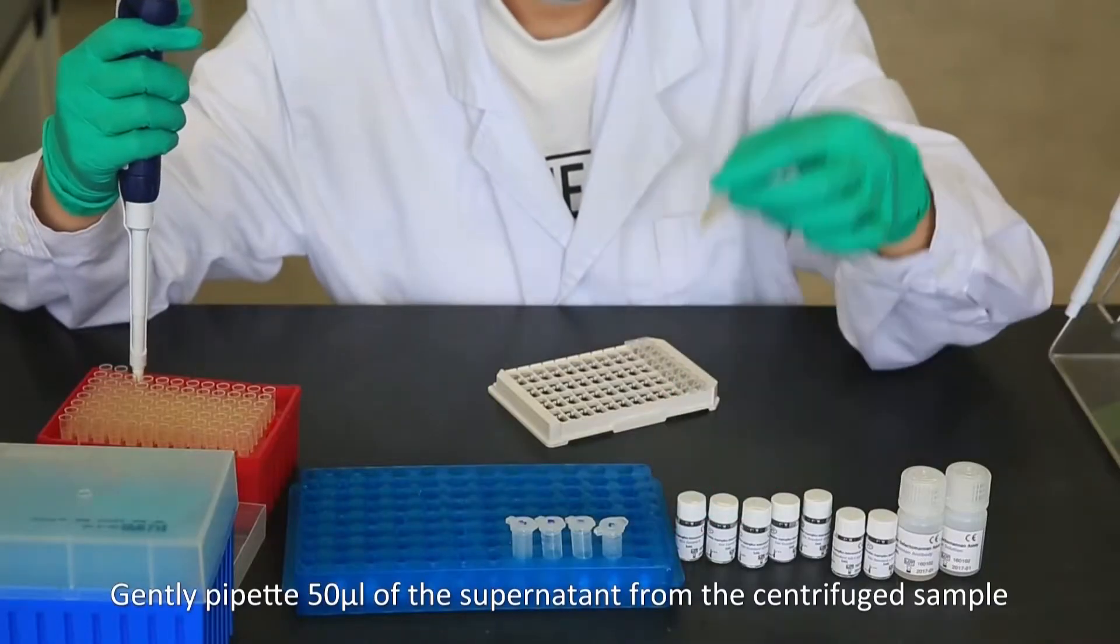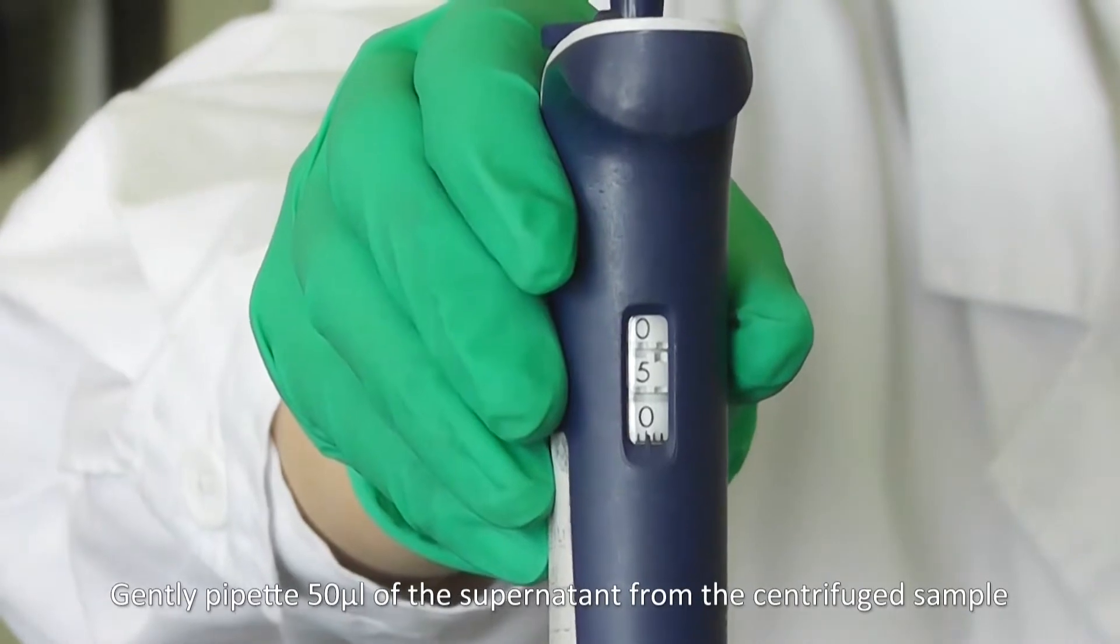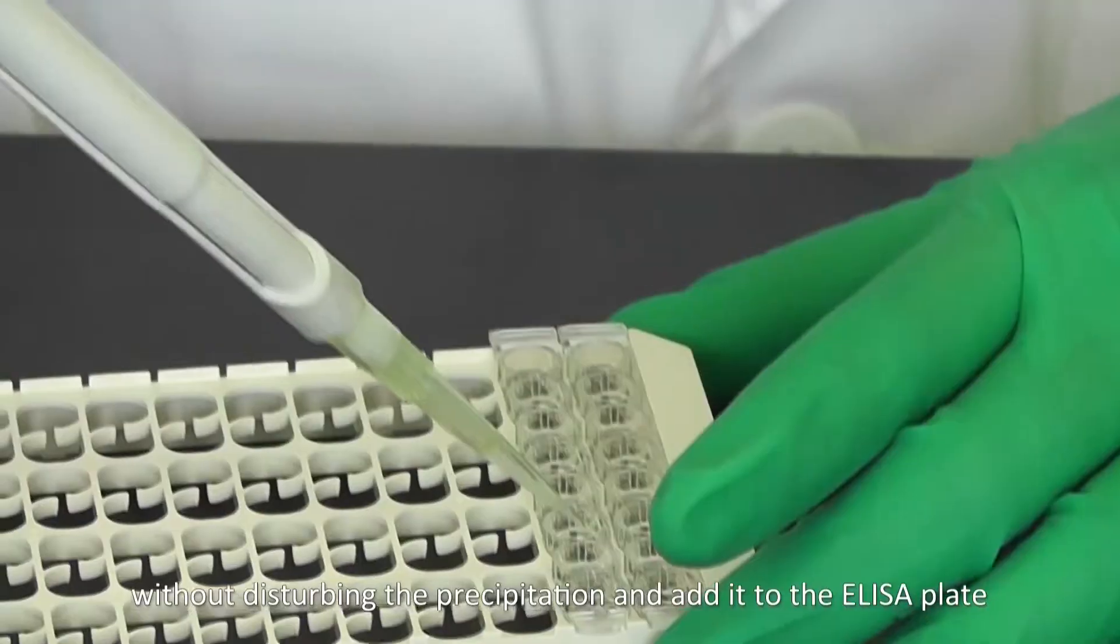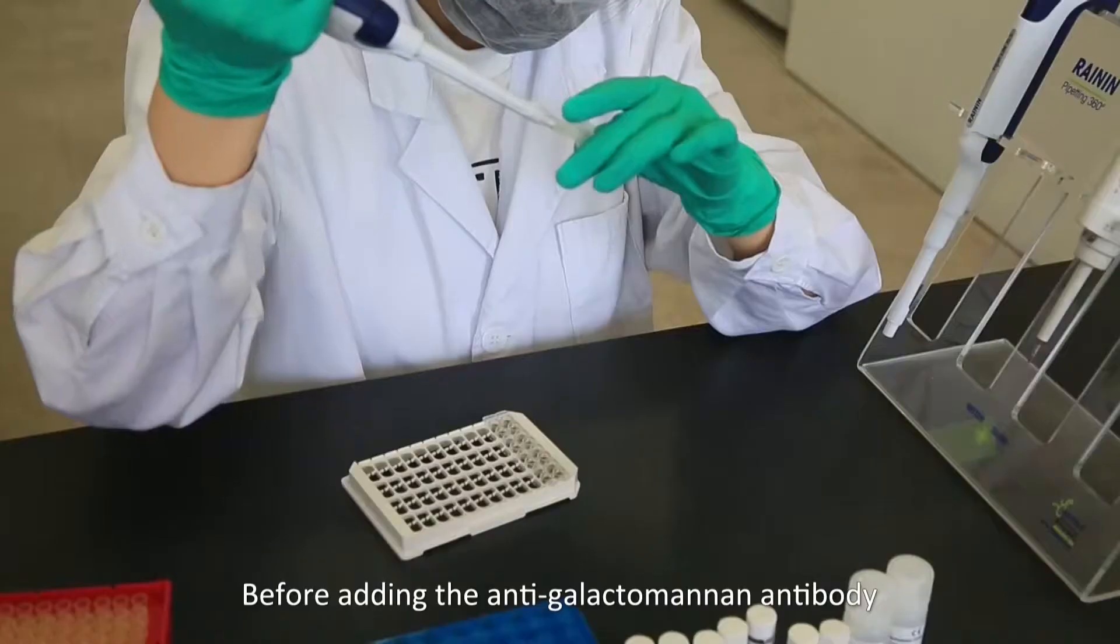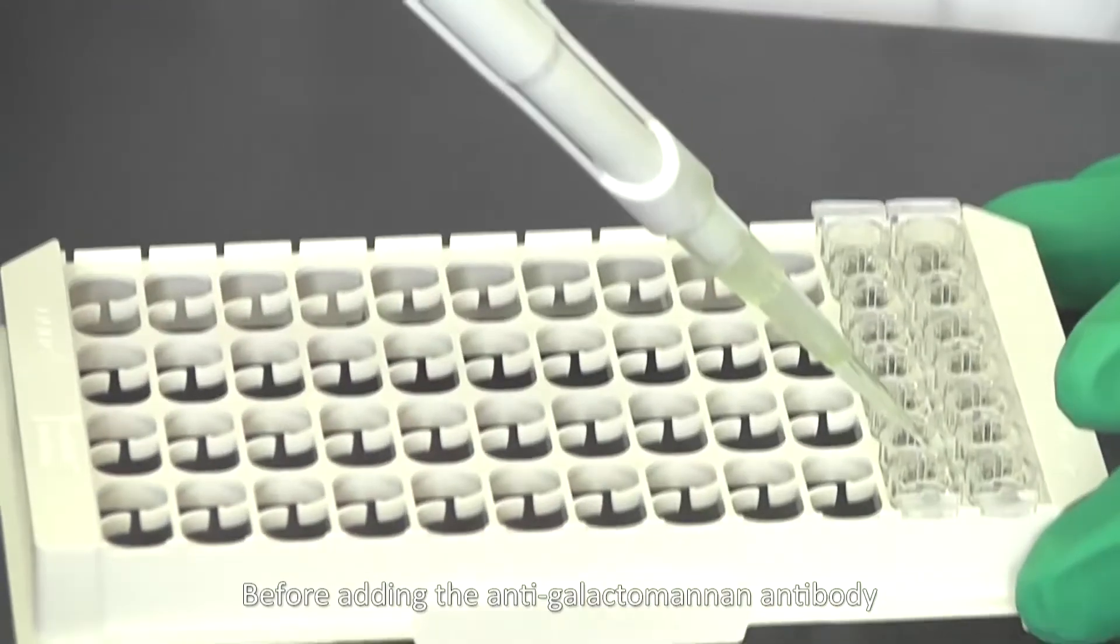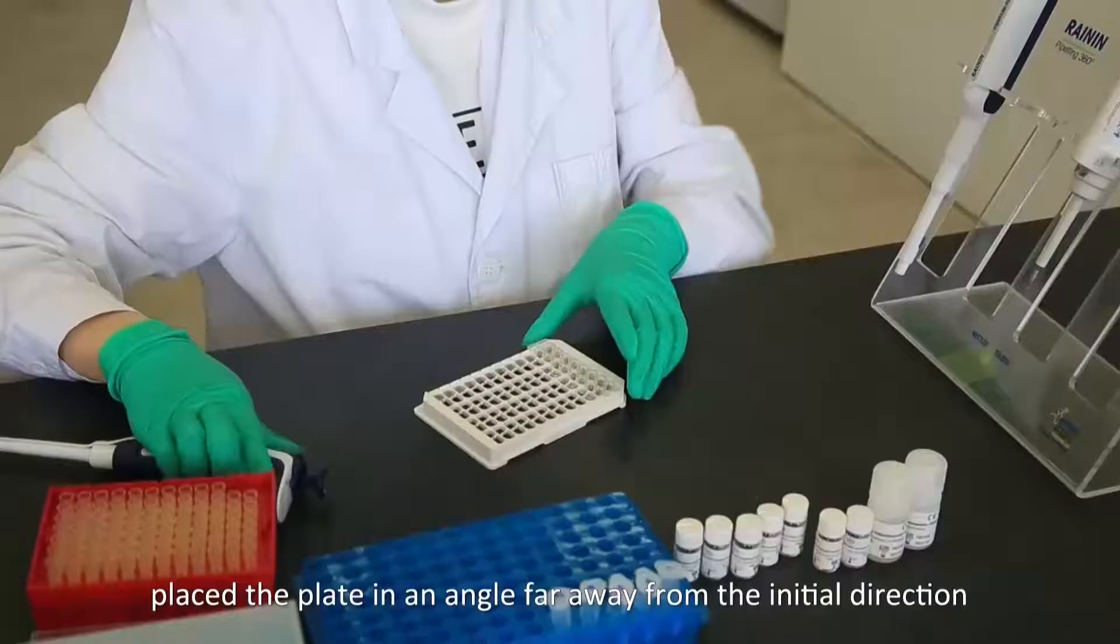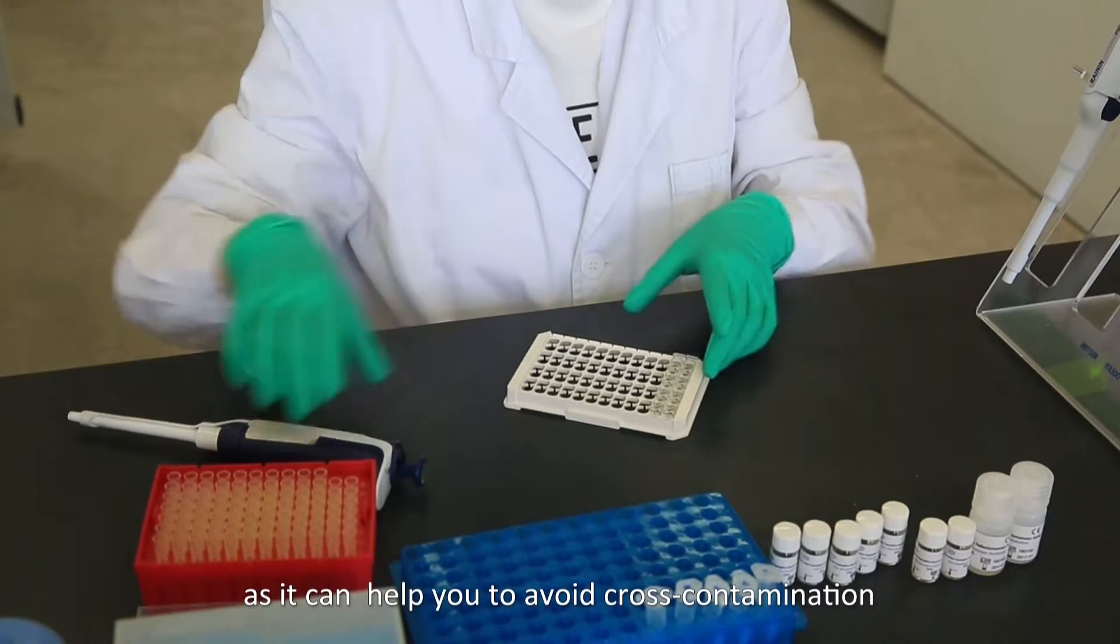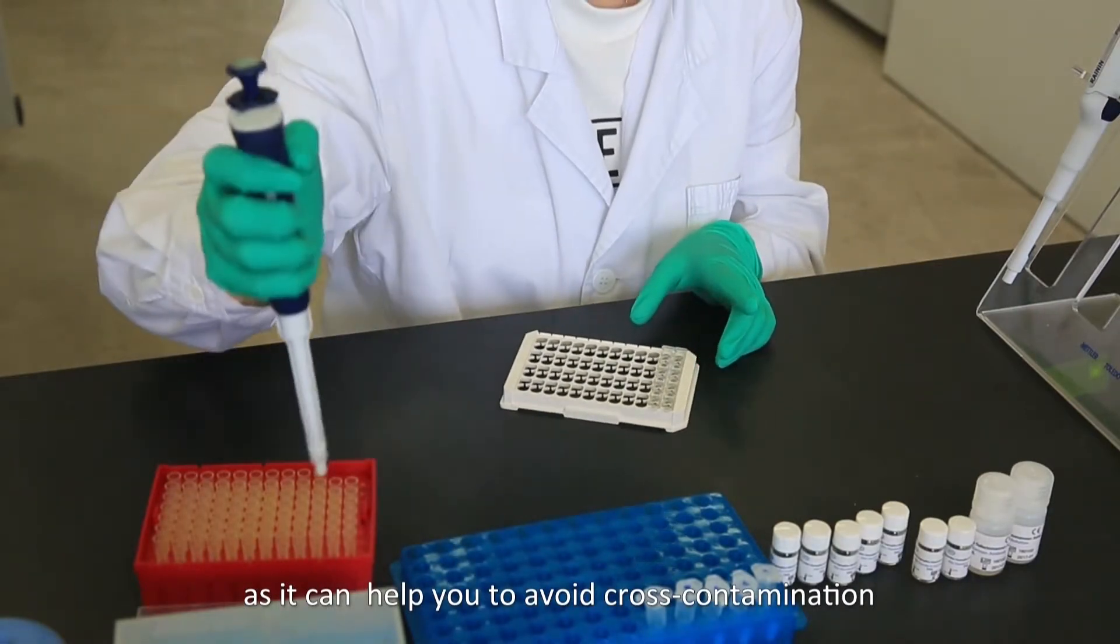Gently pipette 50 microliters of the supernatant from the centrifuge samples without disturbing the precipitation and add to the ELISA plate. Before adding the anti-galactomannan antibody, place the plate in an angle far away from the initial direction as it can help you to avoid cross-contamination.